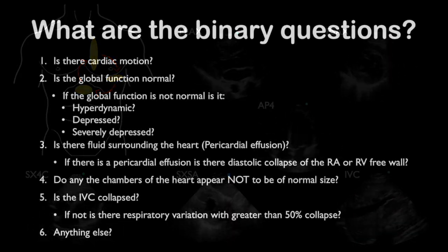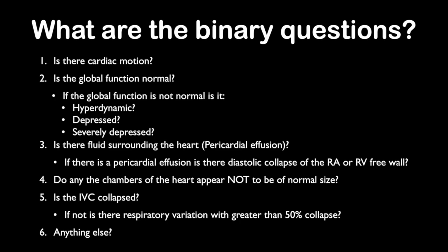When we do a cardiac ultrasound or any point-of-care ultrasound, we need to have very focused goals. These are binary, yes-no questions that help us determine what's going on with our patients. This is getting a little blurred with the more capability we have with our machines nowadays, with artificial intelligence, and some of the things we're going to go through today, quite honestly. But taken in conjunction with what we see in the patient, often we can figure out whether they will respond to fluids or not. We'll talk a little bit about that here for a moment.